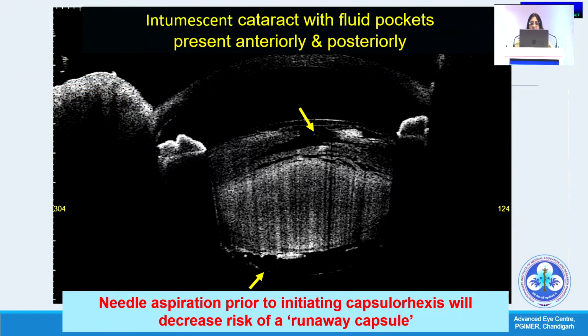On the other hand, in an intumescent cataract with fluid pockets present both anteriorly and posteriorly, it just makes sense to do a needle aspiration prior to initiating the capsulorhexis, which will decrease the risk of an Argentinian flag sign.